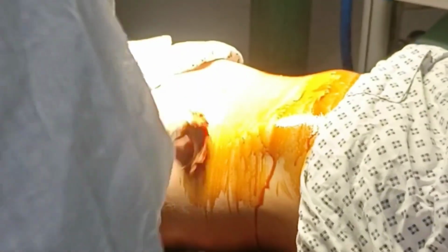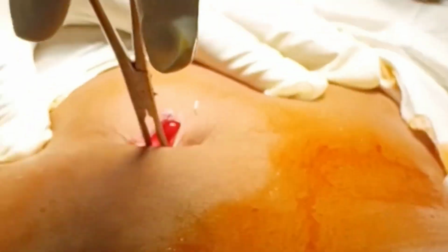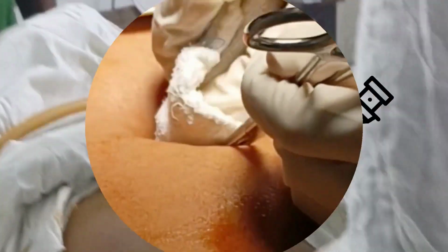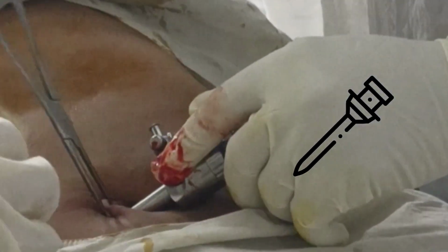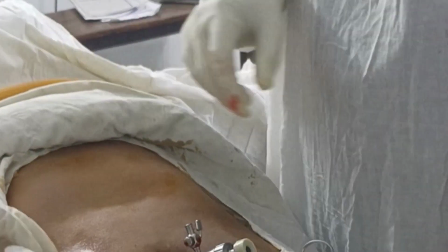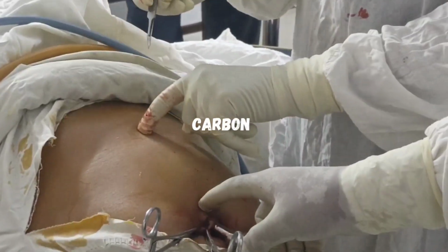We will start with the scrubbing of the patient with povidone iodine or chlorhexidine solution. Then a port is created at the umbilicus. The port should be around 10 mm for the camera. Then we have to pass the trocar through the umbilical port. When the trocar is passed into the umbilical port, the trocar has to be secured so that there is no escape of the pneumoperitoneum created by the carbon dioxide.